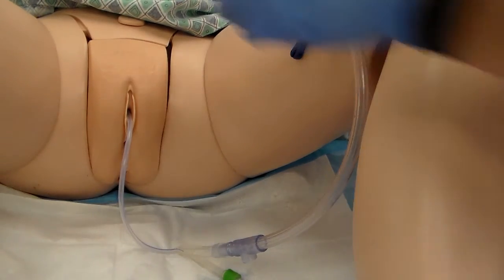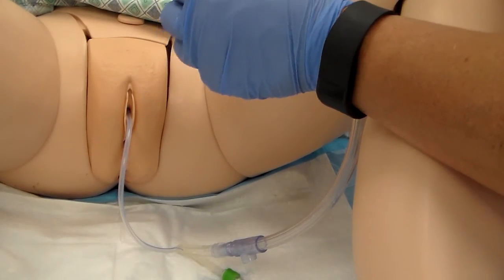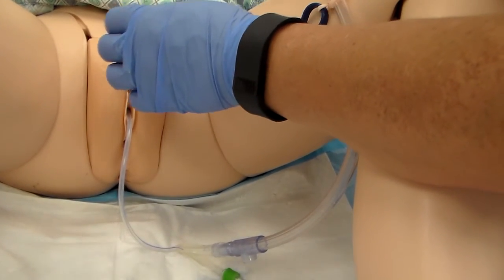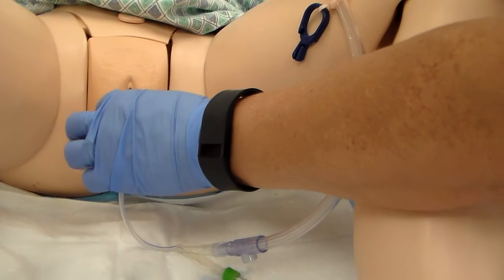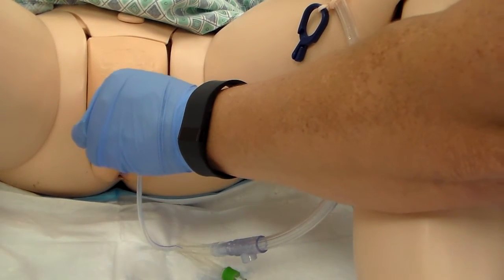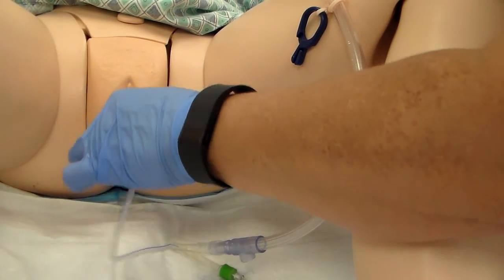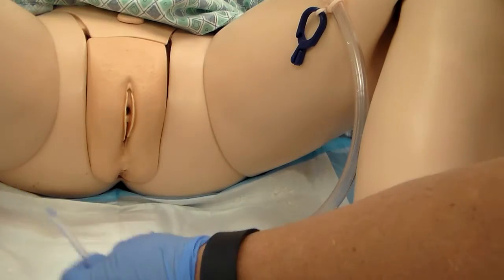Then what I want to do is I don't want to just come and pull, because just in case there's still more fluid in that balloon, I don't want to cause trauma to the urethra. So we're going to give it a slight tug, and see, it's coming through, it's coming through. Okay, and I got it slowly.